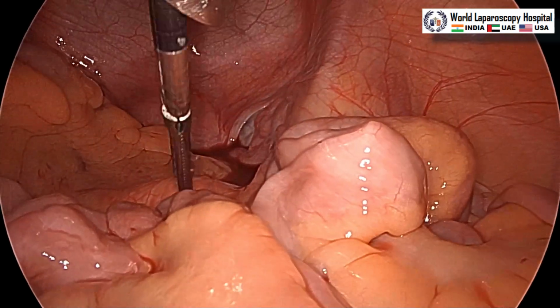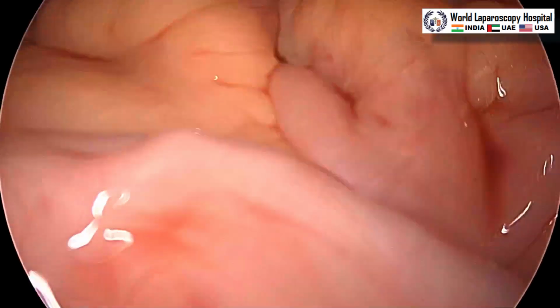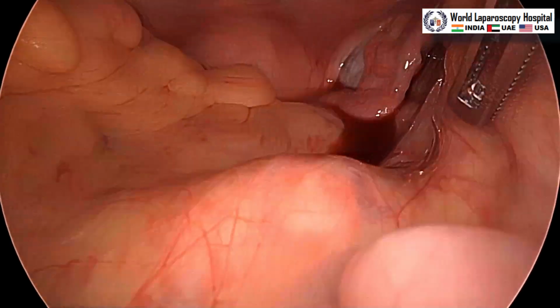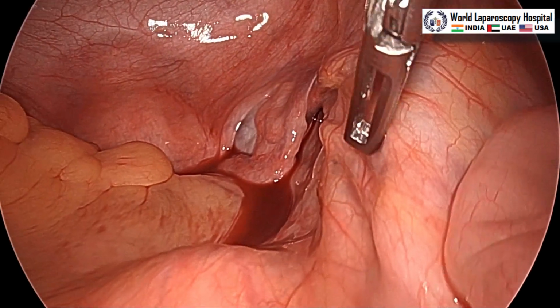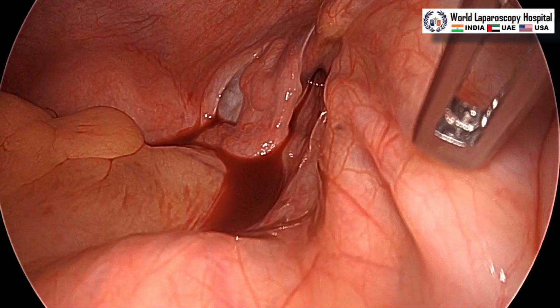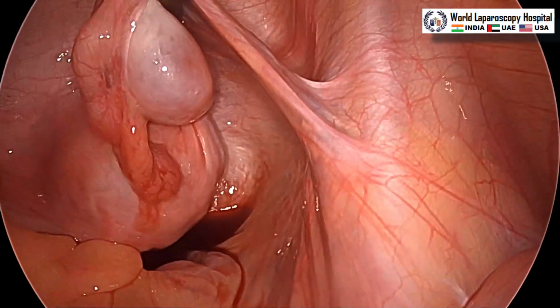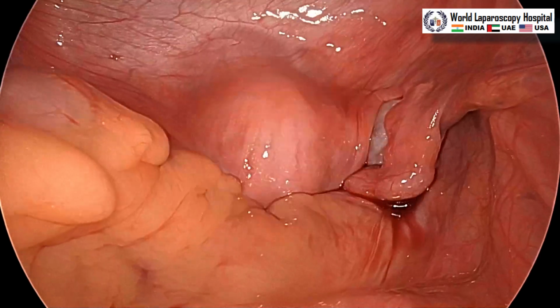Here is the sacral promontory, you can see, this is the sacral promontory, and here we can see the median sacral vessel which is visible. Here is the internal iliac, this is the common iliac, this is the ureter, and just below the ureter the internal iliac is pulsating, and above the ureter the external iliac is visible. Peristalsis of the ureter you can also see. This is the IP ligament, this is the right ovary, the uterus is retroverted a little bit, and this is the left ovary.